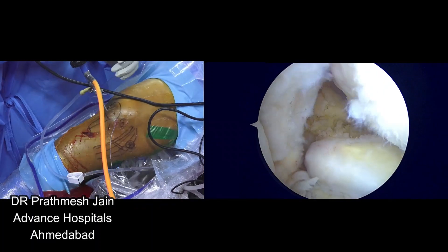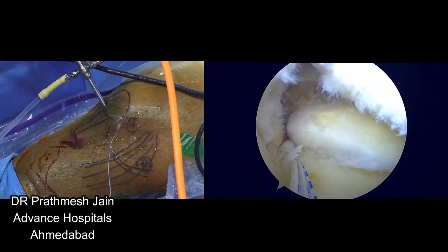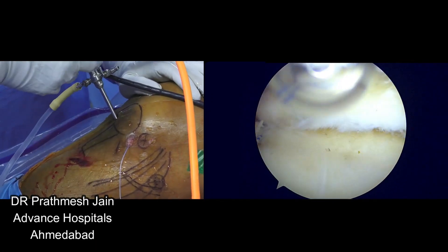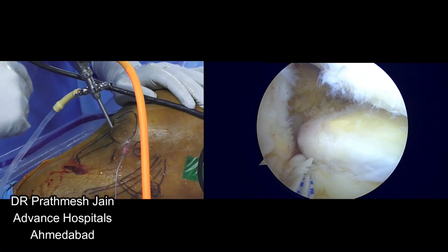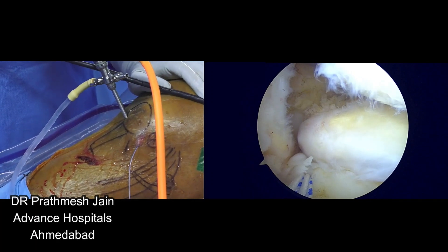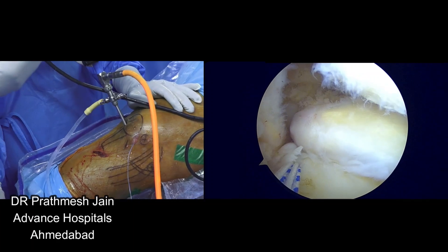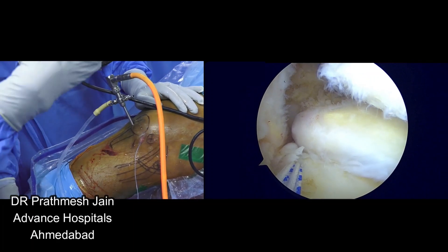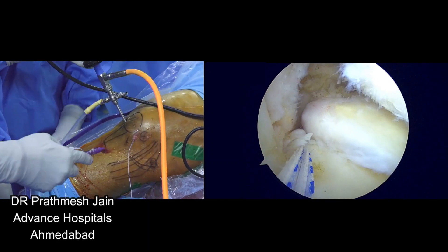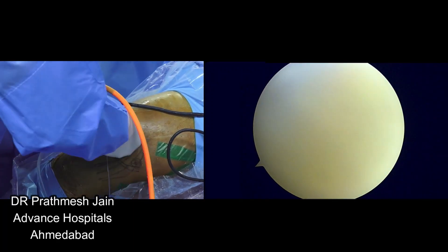These four sutures will now be used to repair the root portion. Now if you want to increase the healing, what you can do at this stage is use a curette to curette out the area surrounding the anchor insertion part to increase the healing potential of the anchor and for the root. This is not a compulsory step, but if you want you can do it at this point. Now what I want to do is to repair the sutures through the root.